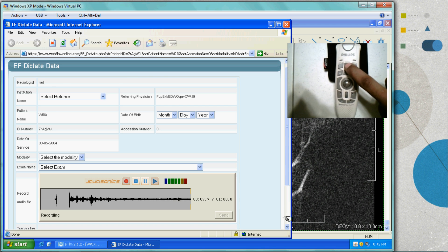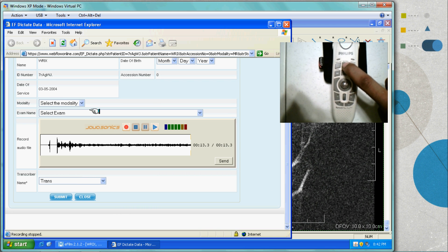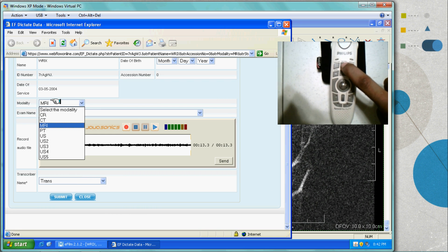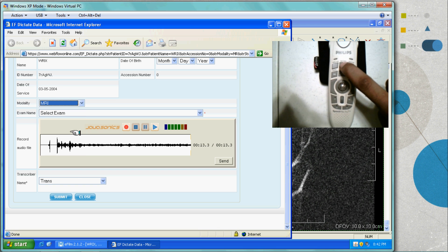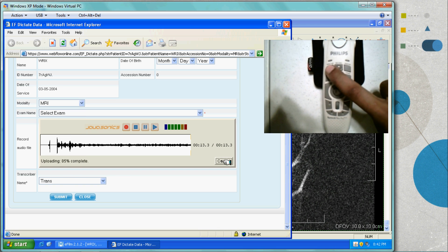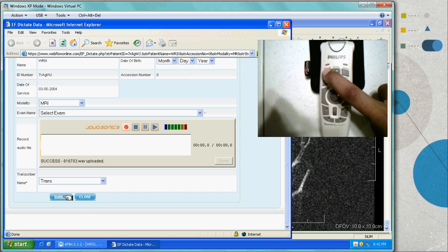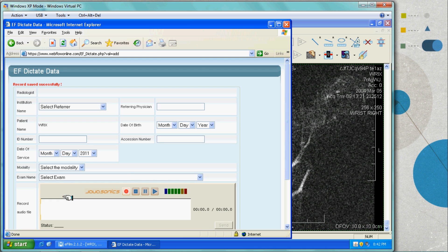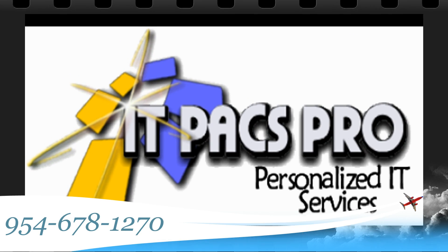Using the speech mic, the user can use one-handed dictation to record audio while interpreting the film. Now using the second button on the speech mic, the EOL button, the doctor can submit the audio and then submit the record to the transcriptionist.